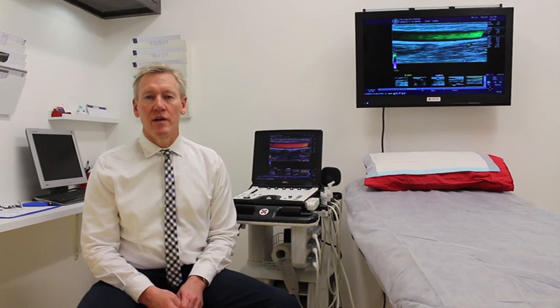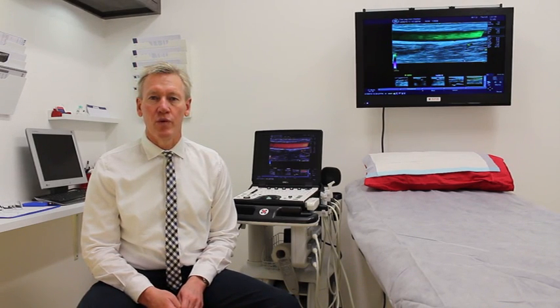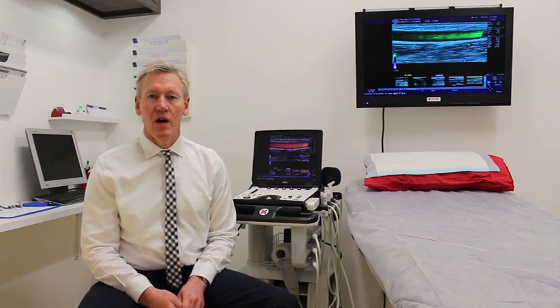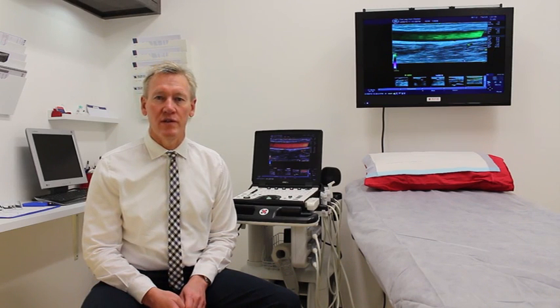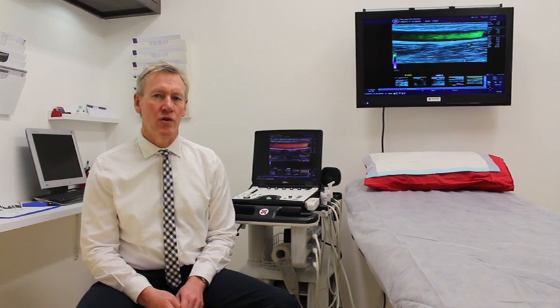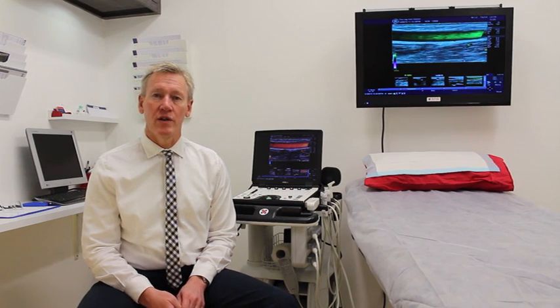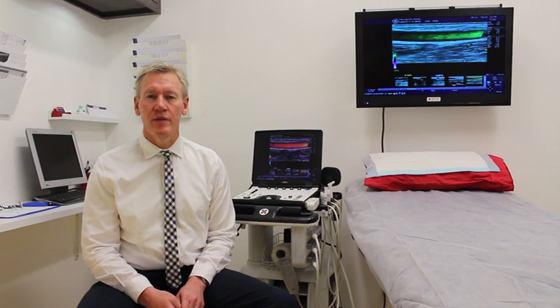They're very common, but by definition a varicose vein is an elevated vein above the skin more than 3 mm in diameter when the patient is in an erect position. Often there may not be very obvious varicose veins on the surface of the skin, and there's serious underlying problems with the venous system. And on other occasions there may be veins that look quite obviously varicose, but in fact physiologically there's not really too much of a concern because the veins are actually working. Ultrasound can help us to establish which veins are working and which veins are not working.